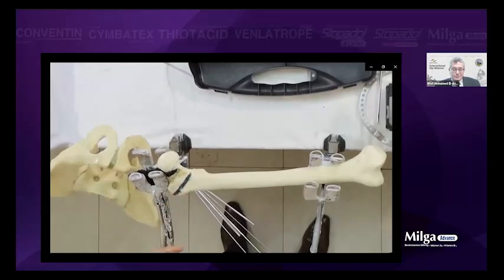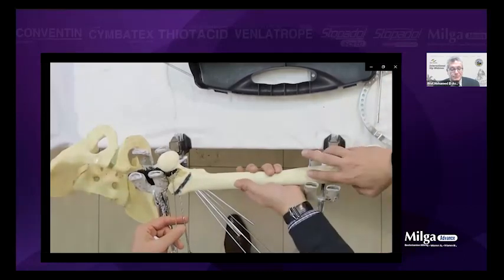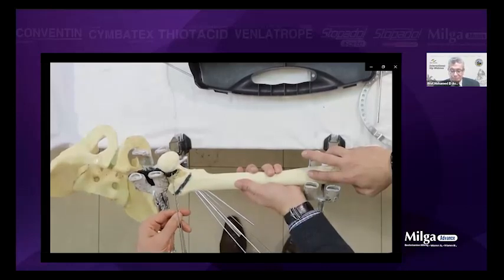How to apply the half pin in that direction? First, you introduce a wire in front of the bone, as you feel it, just in front of the bone, under the image intensifier. And now it's in front of the bone. We leave it just like this. Give me now the drill bit. We go the same direction as the drill bit, through the middle of the trochanter, like this one.